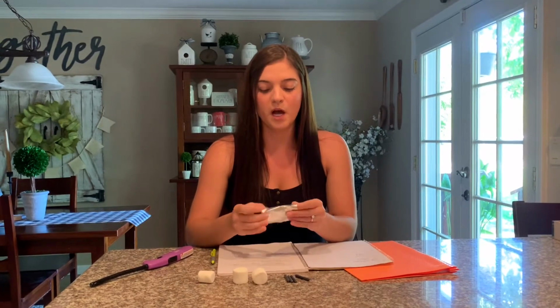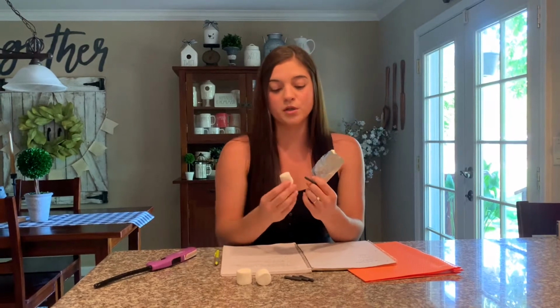One of the main properties of tungsten is that it has a high melting point. Tungsten has a high melting point of 6,192 degrees Fahrenheit or 3,422 degrees Celsius. In this experiment, I'm going to show you and demonstrate the difference between aluminum and tungsten and a marshmallow. In X-ray, only 1% of your electrons are converted into X-rays, where the others are completely heat. 99% of it is heat, which is why we want to use tungsten.